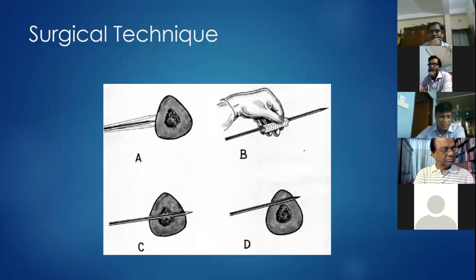And at this moment, the surgeon must try to pull the wire backward slightly. If it is firm and unmovable, the wire is in the correct position. If it pulls back easily, the direction of the drilling must be changed.